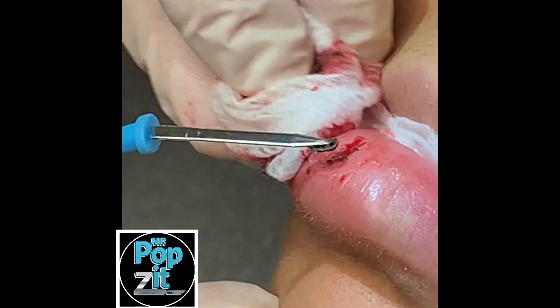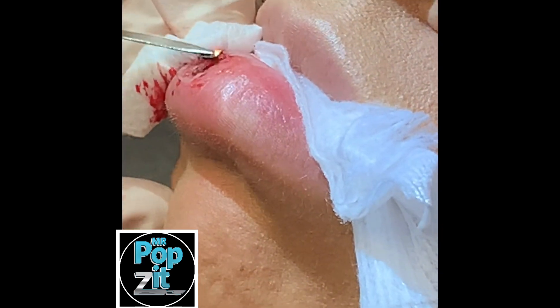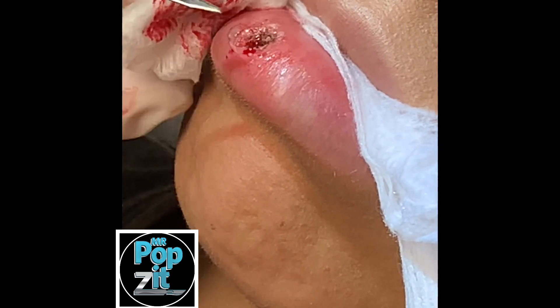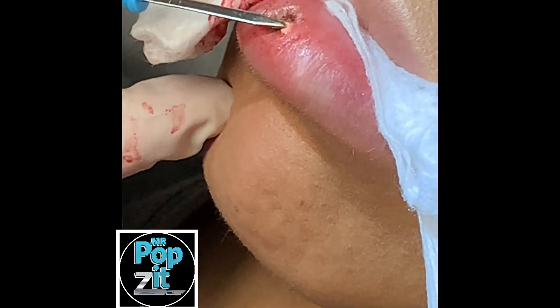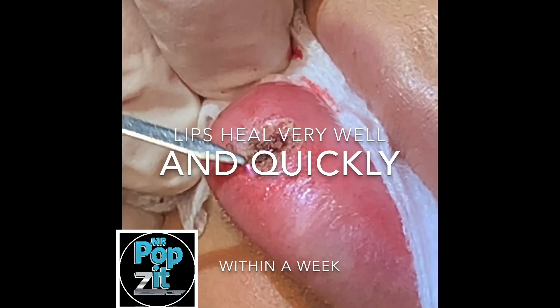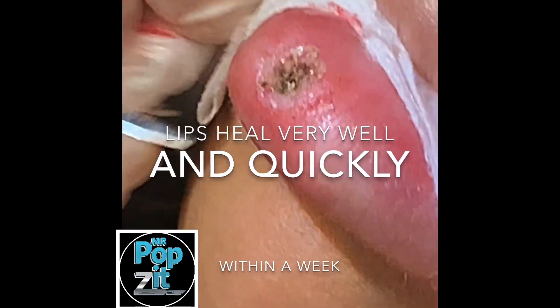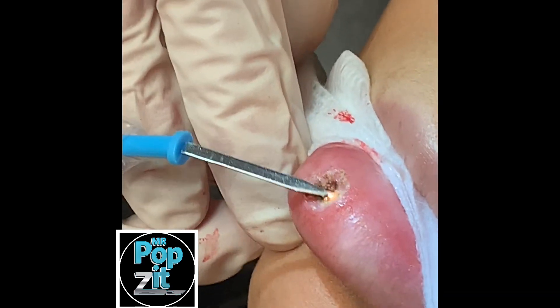Don't worry. Let's get a little bit more gauze. Turn a little bit — this is right there. Perfect, that's looking good. So you can keep Vaseline on it, because when you go to smile, as it scabs and heals, it'll crack a little bit. So keeping Aquaphor or Vaseline will help so it doesn't split or crack again. Just about done — just one more tiny bit at the edge there where the vessel was.